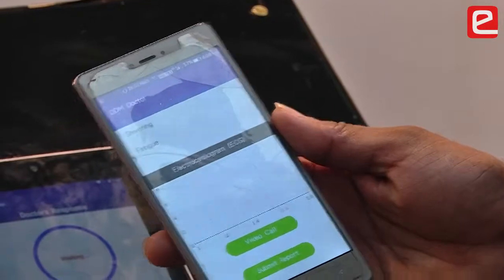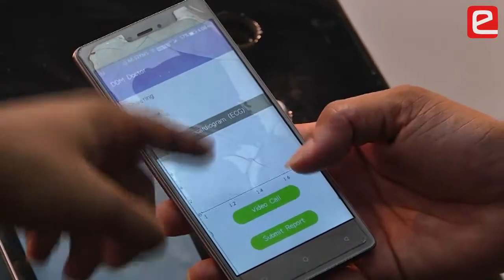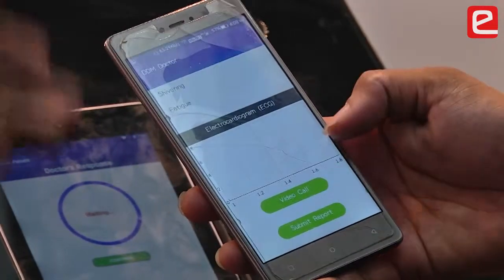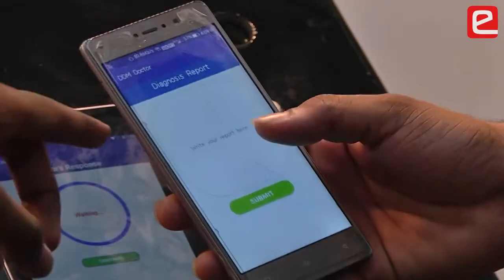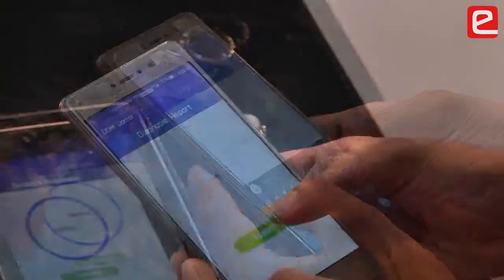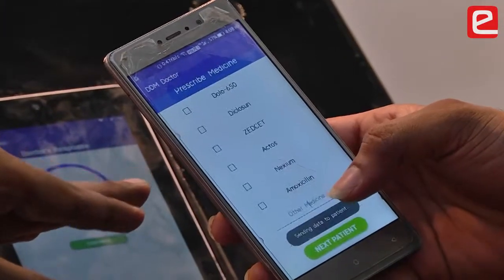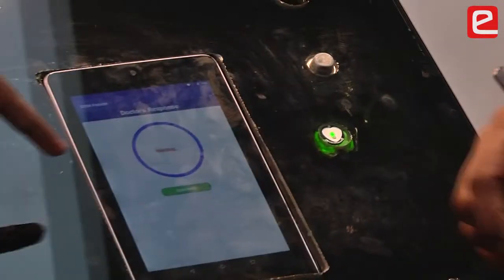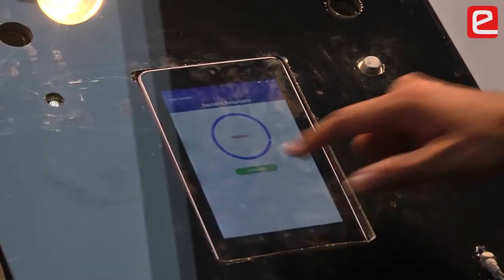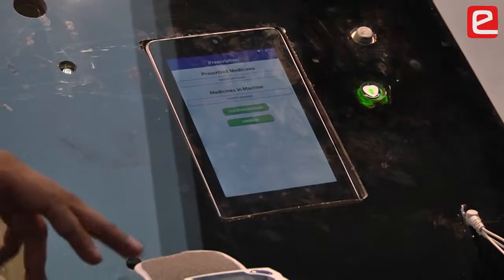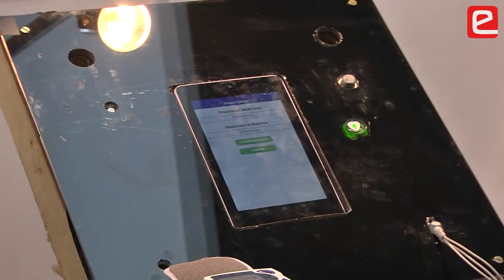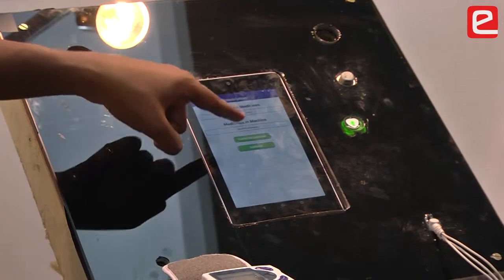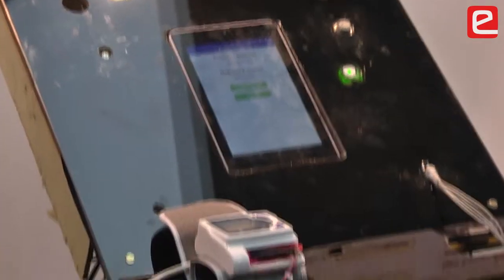If the values are not sufficient for the doctor to make a prediction, there is an option to video call the patient directly to collect more information. If the doctor is satisfied with the report, he clicks the submit report button and types the report for the patient. Once the report is sent, he can prescribe medicine by searching within the app. From the PatientSide app, the doctor's report and prescription are displayed. The patient can then click the dispatch medicine button and the medicine will be dispensed from the machine.